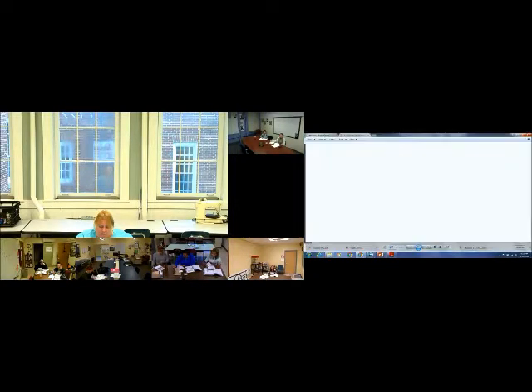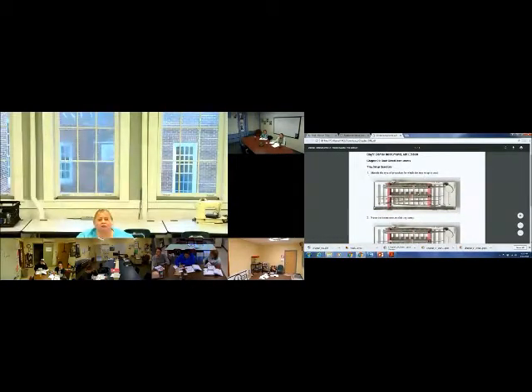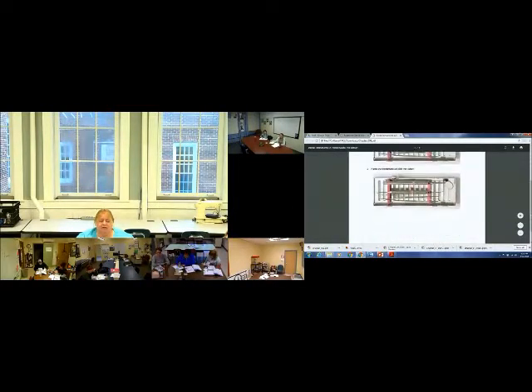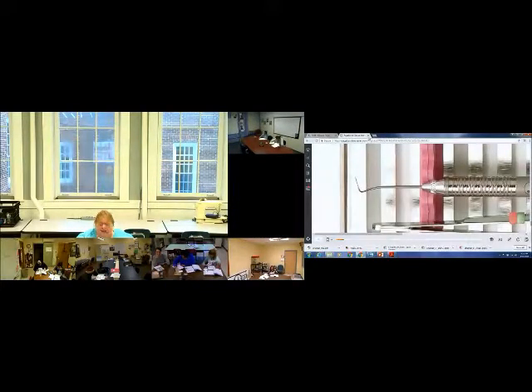So our first exercise for our dental instrument of the day, what type of procedure is this tray setup used for? And we could say all of them. All right, so every procedure requires a basic setup. And name the instruments on this tray setup. And we would say mirror, explorer, cotton plier. And if this seems all pretty basic to you, trust me, it gets worse. All right, so that's your dental instrument of the day.